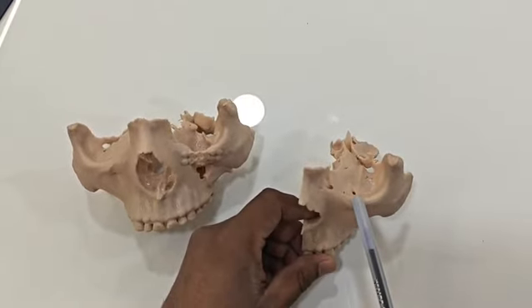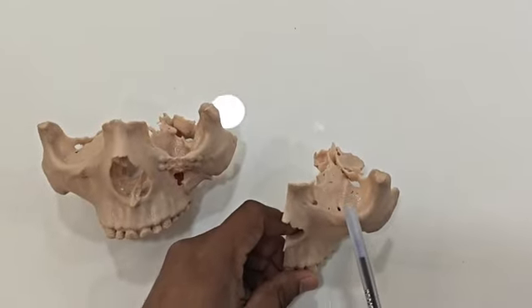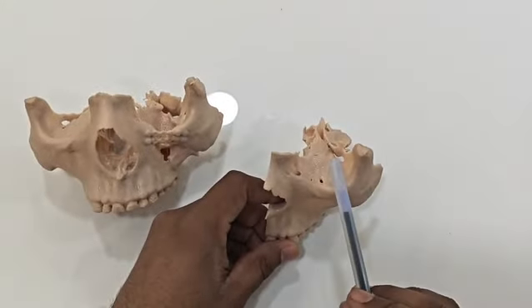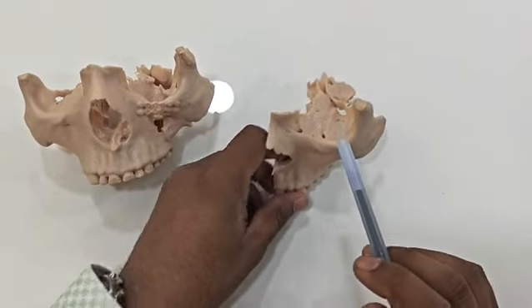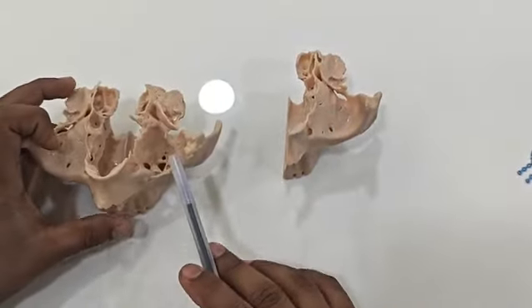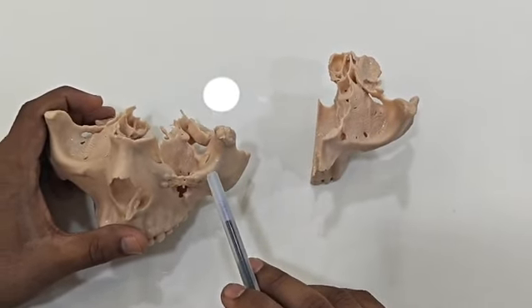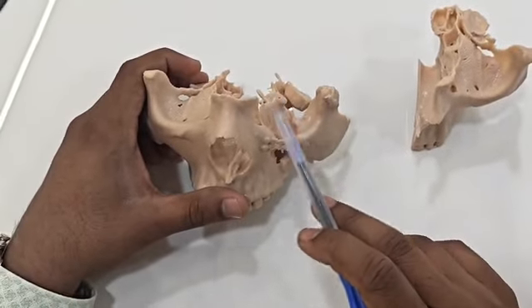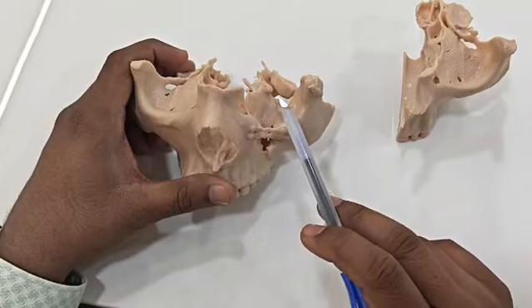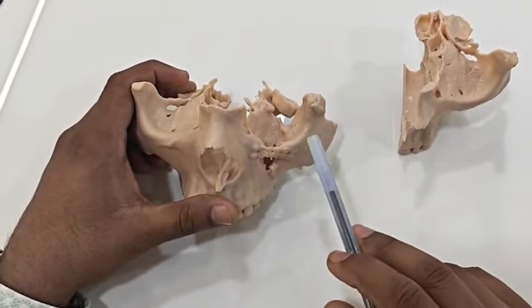Now if you see this particular model, there is a reconstructed orbital floor with the mirror image of the healthy side. Now we are planning to adapt the titanium mesh on this particular model. We will try it with the fractured site, and eventually the same pre-contoured plate we will take to the operating theater and just place it in the floor of the orbit, so we don't have to bend much at the time of surgery. There will be a limited operating time.